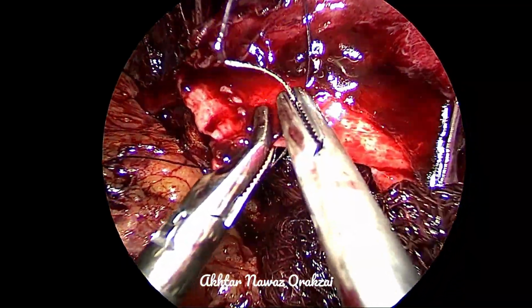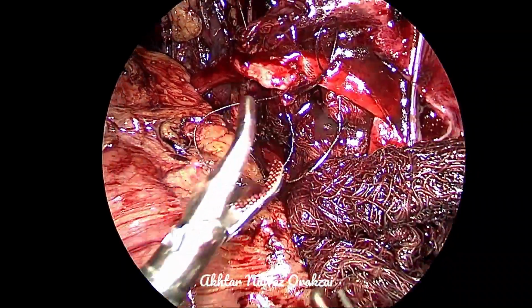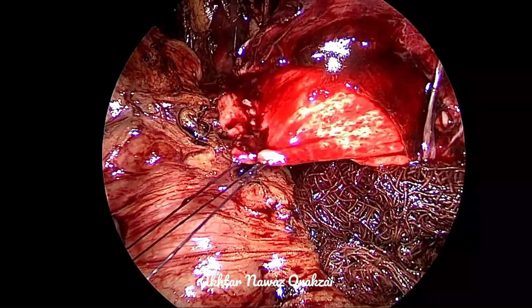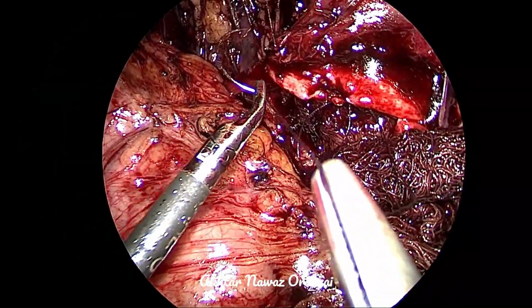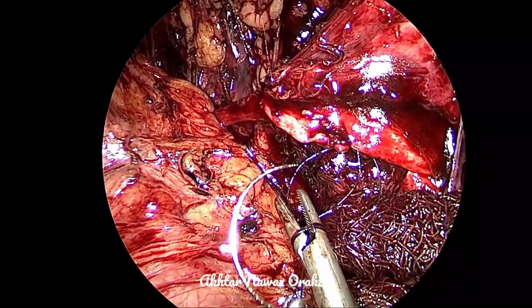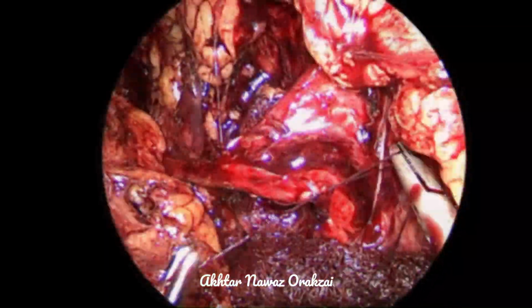So talking of the principles of pyeloplasty, there should be no tension, and it should be watertight, and it should be adequately drained by a DJ stent or a nephrostomy tube, and the redundant pelvis, if any, has to be resected so that the system is not atonic.